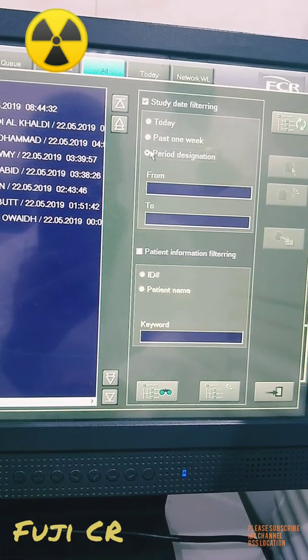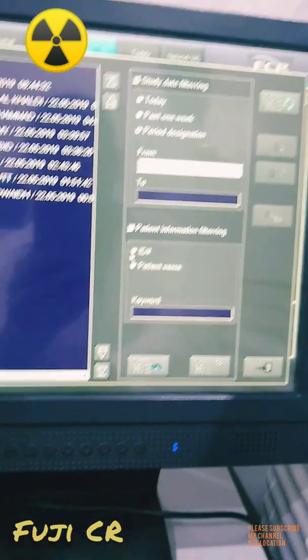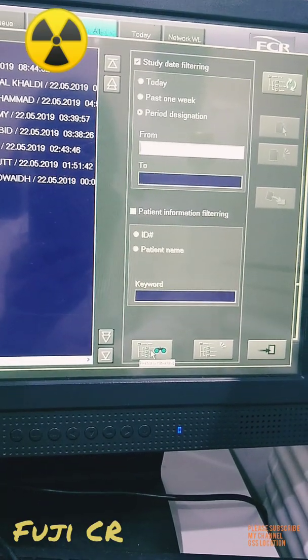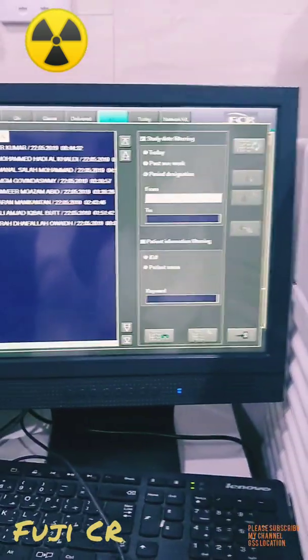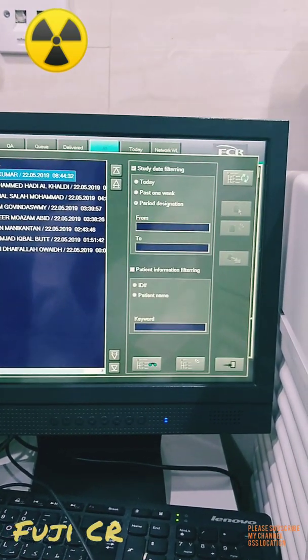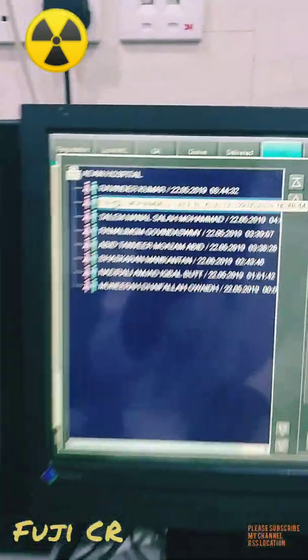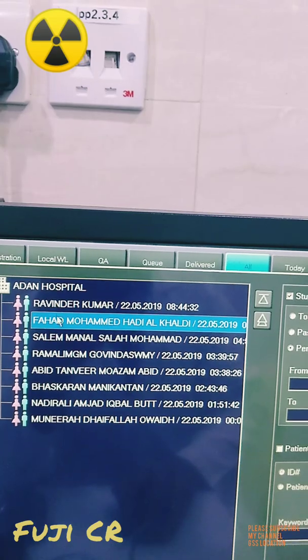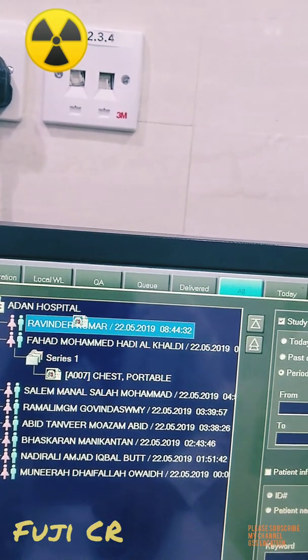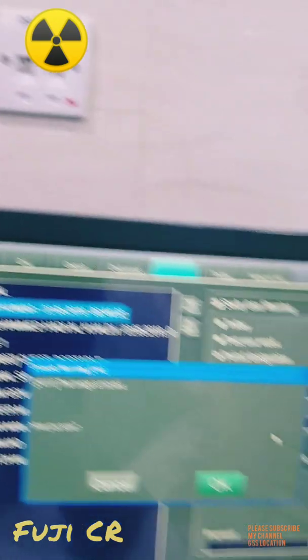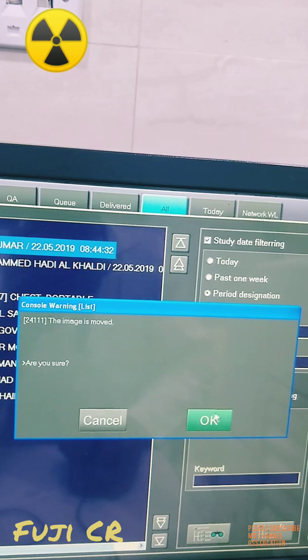Once you select your filter, go to the Patient List on the side. It will show patients filtered according to your selection — today or one week. For example, if the correct patient is Ravinder Kumar but you accidentally did the X-ray under Fahad Muhammad, click that incorrect case, then drag and drop it onto the correct patient. It will ask you to confirm.